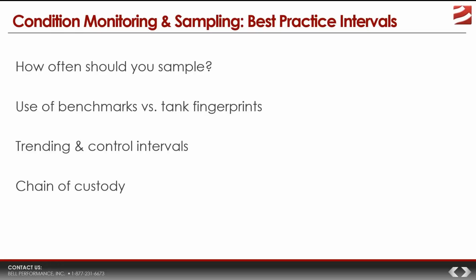And so, when we do an ATP test on a given sample, and we get a number that's supposed to indicate microbial units, number of microbes that's in a milliliter of it. And so we'll get a number and we'll say, okay, the guidelines for interpretation here say that if you've got more than 10,000 microbial equivalents, that's basically the fancy way of saying microbes. If you've got more than 10,000 microbes per milliliter in this fuel, you have a problem. Or the exact words would be, typically indicates a problem.